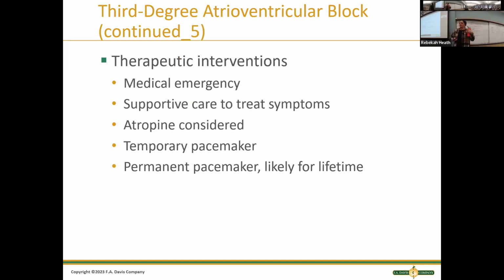What do we do about it? So we might do, like we talked about, they might need a pacemaker, but we might do temporary pacing as well, which just like you have patches that you'd put on somebody, like with an AED or defibrillator, you can actually do pacing through those. Usually I've only seen it done in the ICU. You won't have to do it elsewhere, if you're in the field somewhere maybe to start it, and they do it through those patches.